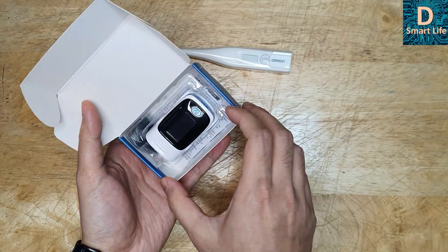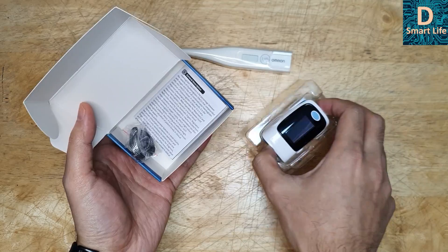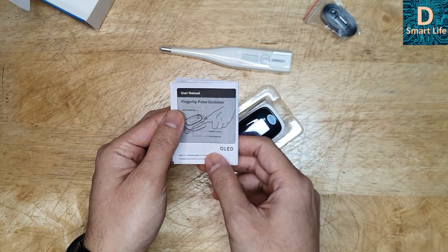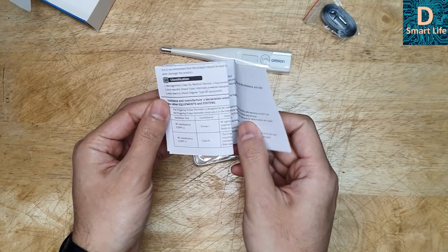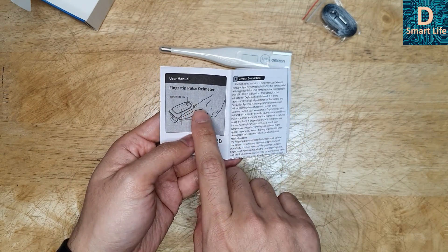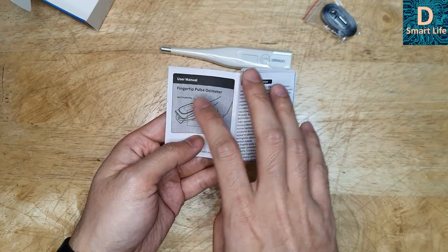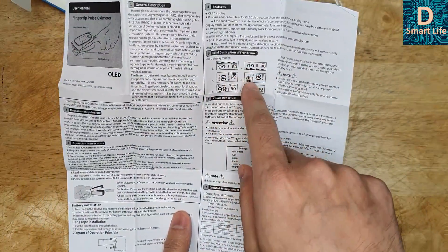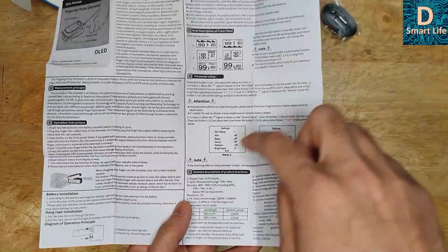So it comes like this — with a lanyard and the user manual, which is in English. You just have to put any of your fingers into the device. It comes with an OLED screen with different kinds of displays and it has alarm functions.